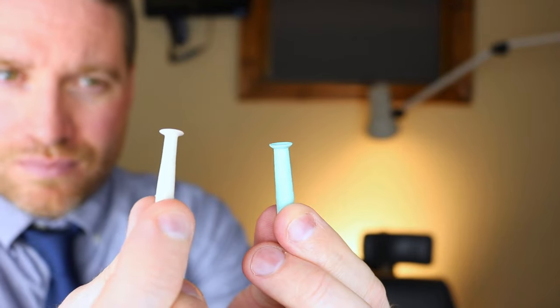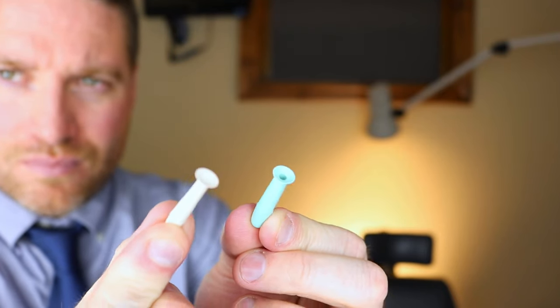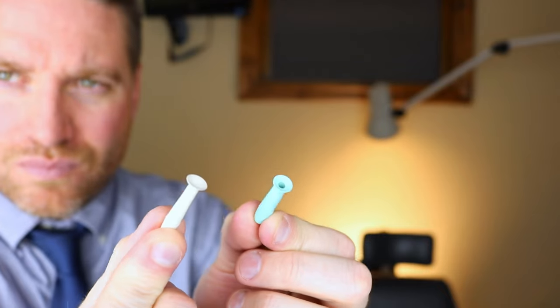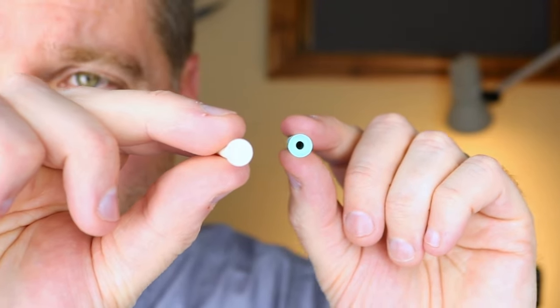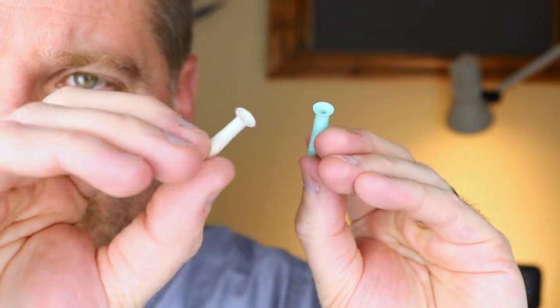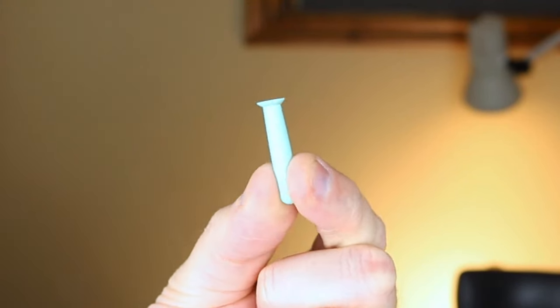Now for taking the scleral contact lens out, we're going to use a different type of plunger — a smaller suction plunger. There are usually two different types: one has a hole that you can squeeze to create suction onto the contact lens to get it out, and one without a hole that you push onto the lens, creating suction kind of like pushing a suction cup onto a window. Either way, these will help you pull the contact lens out.